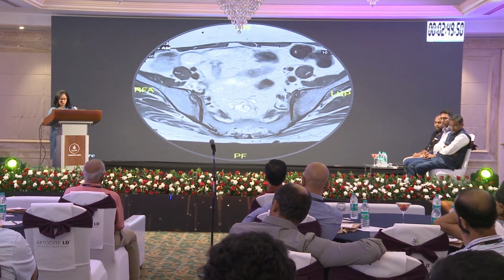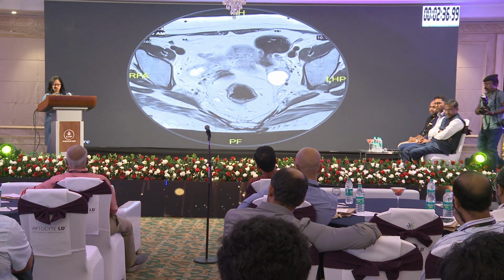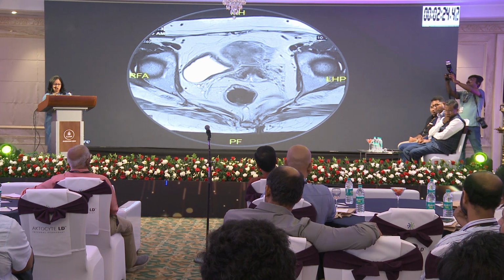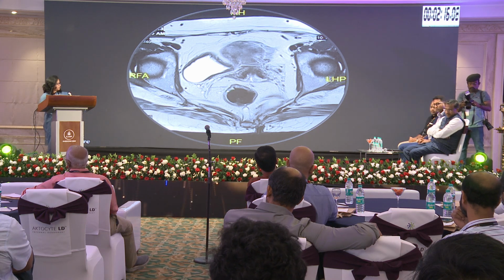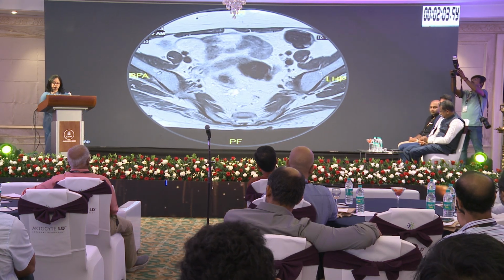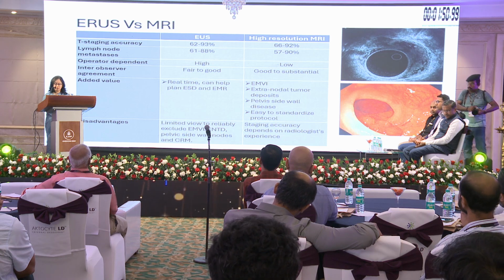In this example, I want to demonstrate a T2 hyperintense mucinous tumor, which again has EMVI that is far away. These EMVI and tumor deposits are so far away from the primary tumor, which is sitting in the anterior wall of the low rectum. As I scroll up, you can see tiny T2 hyperintense nodular deposits on the rectal wall. This is again a skip lesion. As I scroll up one more time, you can see another skip lesion, and there are tumor deposits and EMVI much farther away from the low rectal cancer, which is almost at the anorectal junction. So with these two examples, I've demonstrated the strength of MRI over endorectal ultrasound.